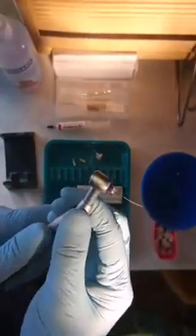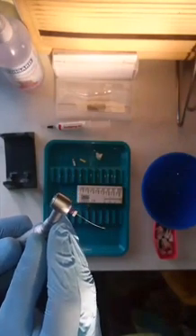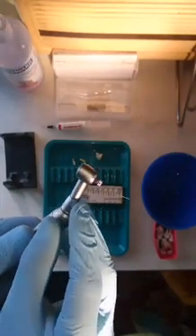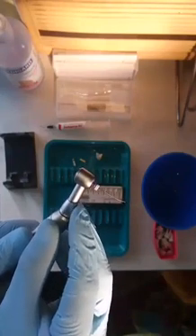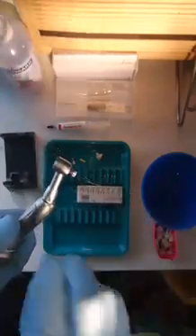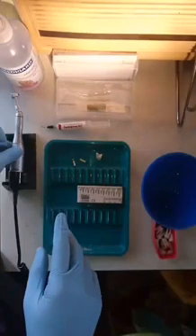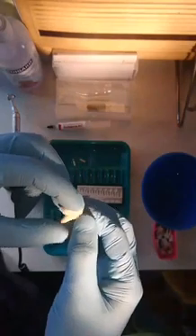You can see the action here — the handpiece goes left and right, left and right, mimicking the action of the hand. Now I have a minimally prepared access on this tooth, and you can see there are quite calcified areas in here as well. I managed to achieve patency using the hand file.